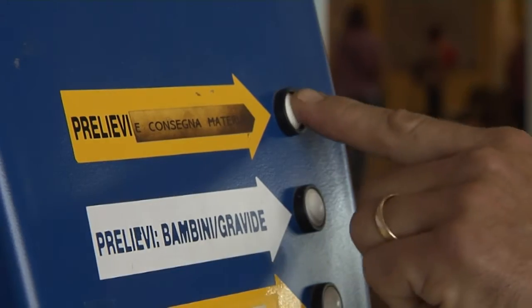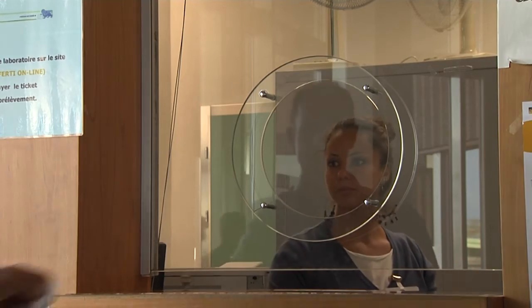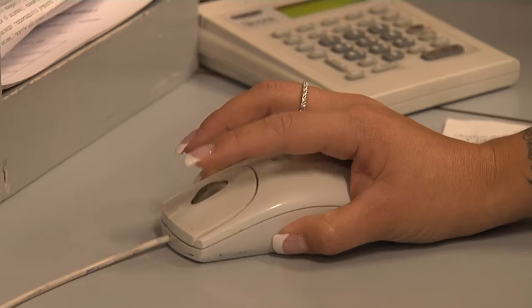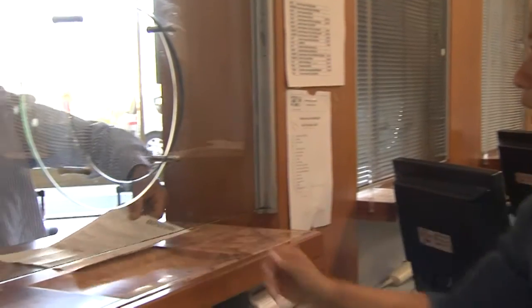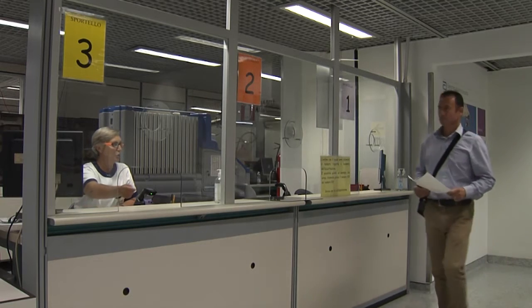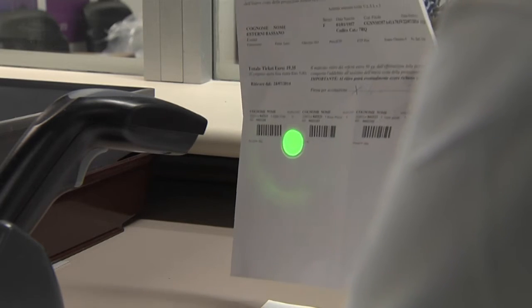Patients who go to the laboratory for blood tests take a priority number and go through the reception procedure. Subsequently, they wait to be called for sampling. Before the sampling, the patient is identified and the Lab.E.L instrument produces the kit dedicated to that patient, containing all the material required for the sampling.